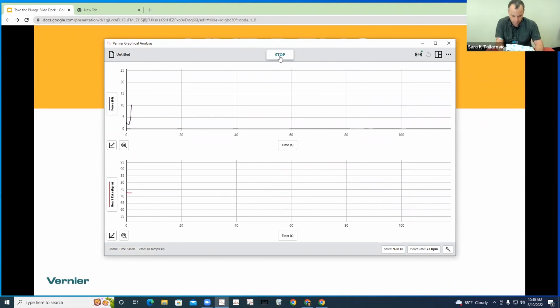So we'll go ahead and start data collection. Just get him breathing. I do think that it would be a kind of a fun inquiry-based exercise if students explored how cold the water needs to be to trigger the actual dive reflex versus just the breath hold response. All right, so John, take a nice deep breath and hold it and stick your face on the ice pack.